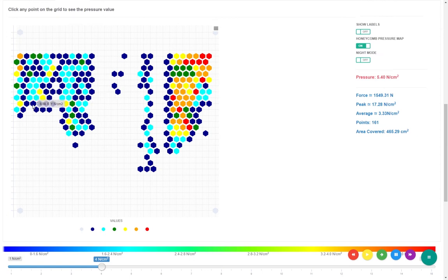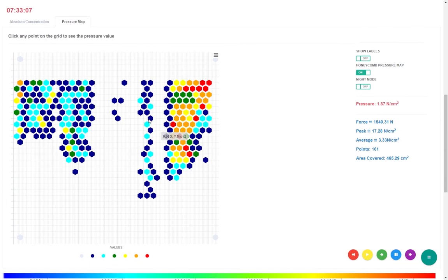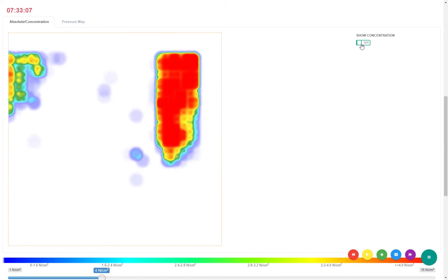Pressure can be measured in absolute view or concentration view. Absolute pressure is pressure exerted at a specific point. Concentration of pressure is the effect of pressure on the adjacent point, causing the pressure to increase on the entire area.